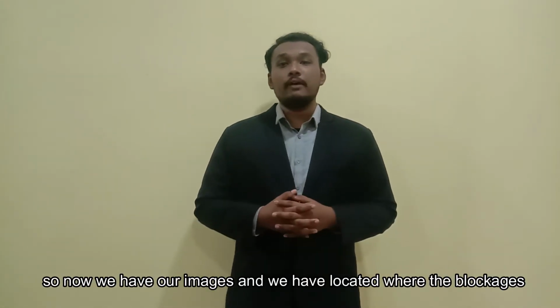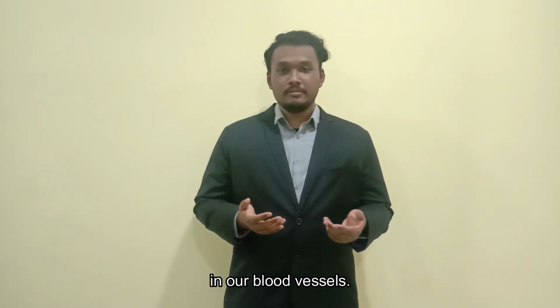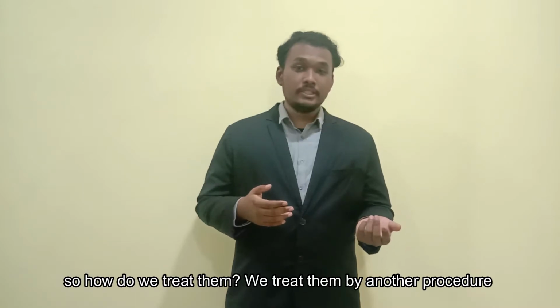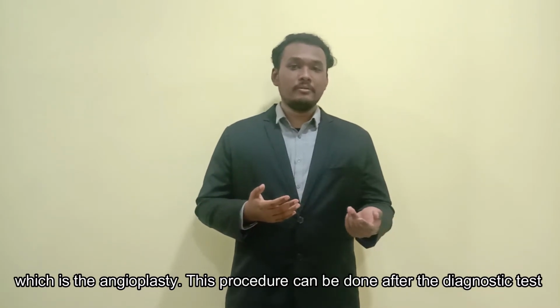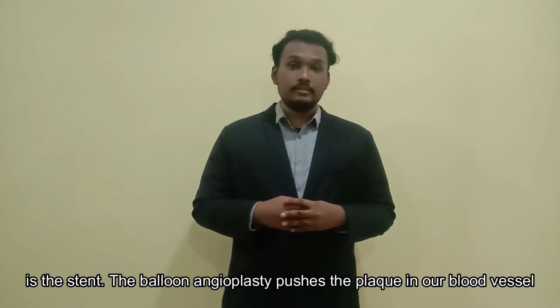So now we have our images and we have located where the blockages or the restrictions in our blood vessels are. So how do we treat them? We treat them by another procedure, which is angioplasty. This procedure can be done directly after the diagnostic test. There are two types of angioplasty. One is the balloon angioplasty and the second one is the stent.